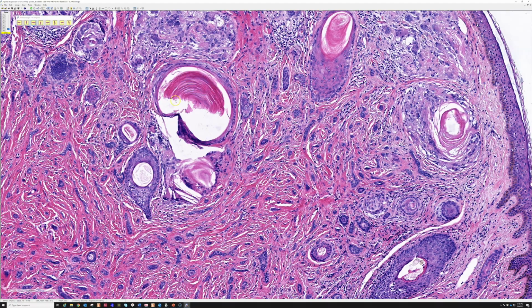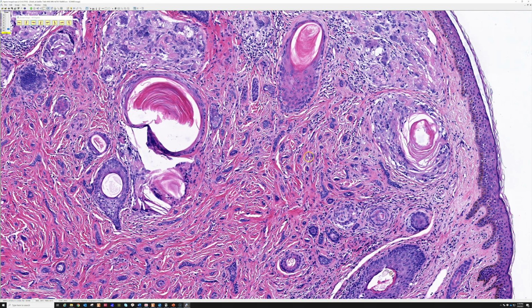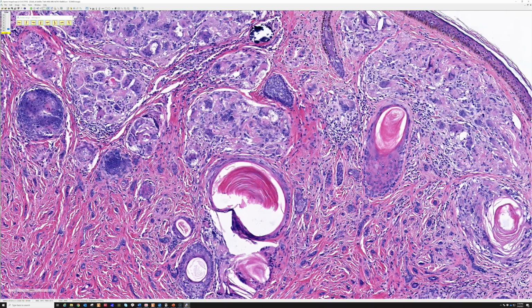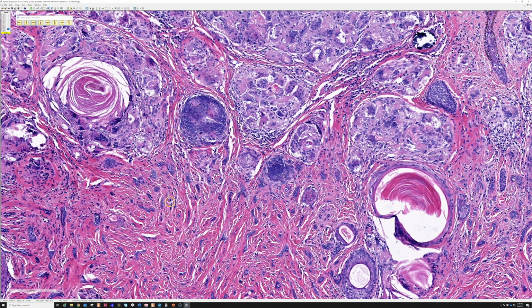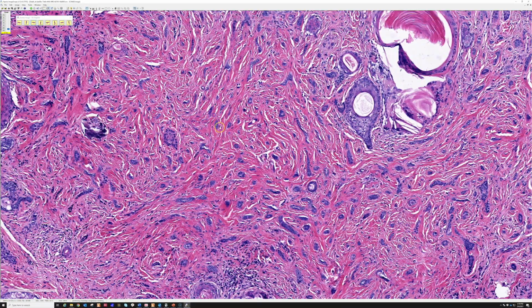If I have a shave and I'm not sure, I may say I favor desmoplastic trichoepithelioma, but I can't see the base, and I usually recommend they do a small excision so that I can see the base, or at least give me a punch so I can see the base of the lesion. These are relatively uncommon. I only encounter them a few per year maybe, so it's not like I'm telling people to do unnecessary re-excisions left and right. I only encounter this occasionally, okay?